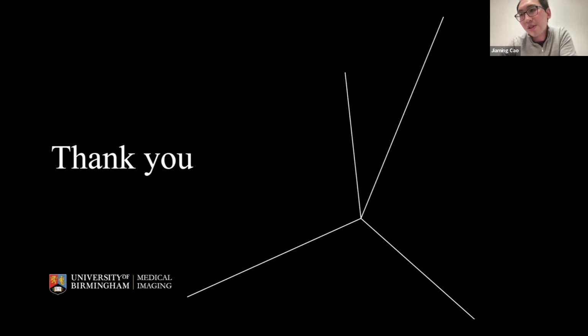Well, that depends on how large the region of interest is. I would say it is more related to the density itself rather than the exact numbers. Is there a minimum? Theoretically, you can do it with any number, but it's not going to look very good. Of course, I would say the rule of thumb is that if you have this 2 centimeter-ish separation between sources and detectors, and you have a reasonable density, you should be able to do something. But it's really a case-by-case thing. It's hard to give an exact number. But there's no maximum that I know.